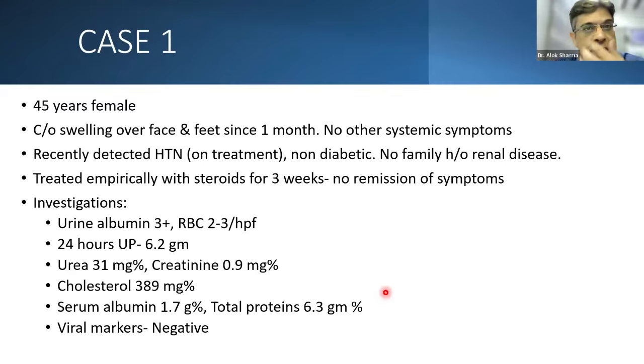So this was the first case. I think I can toggle between the scanned slides also. So just give me a moment. So we'll start with the first history. This was a 45-year-old female who had a swelling over face and feet since 1 month, and recent hypertension. And before doing a biopsy, she was also treated empirically with steroids for 3 weeks. So that's what usually happens.